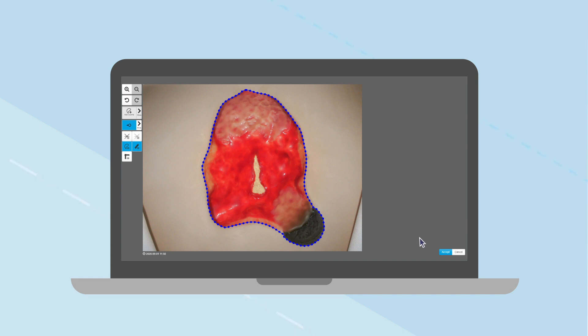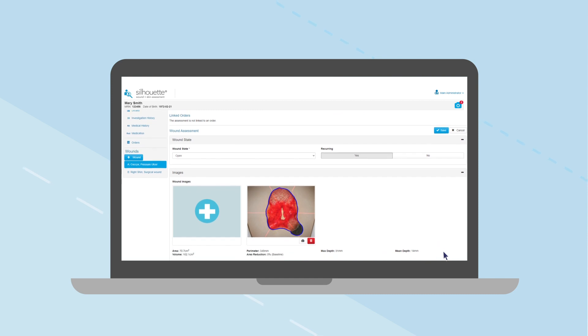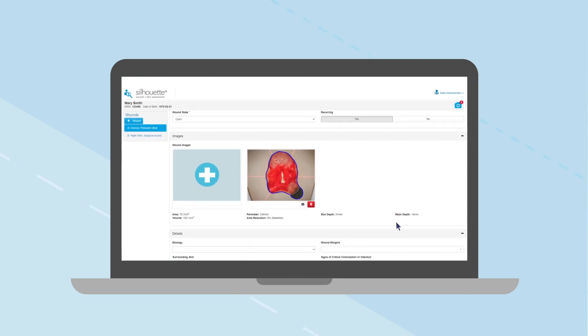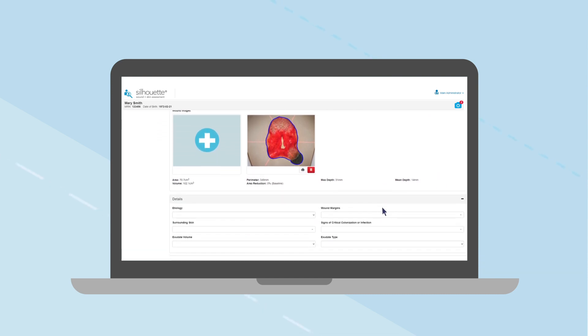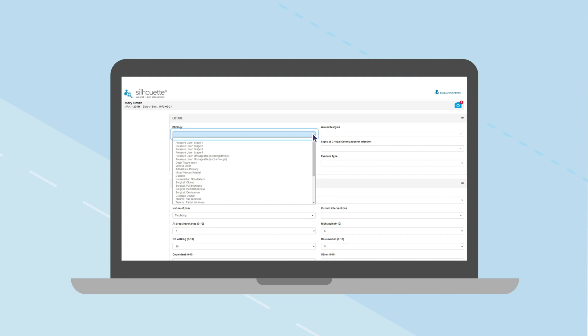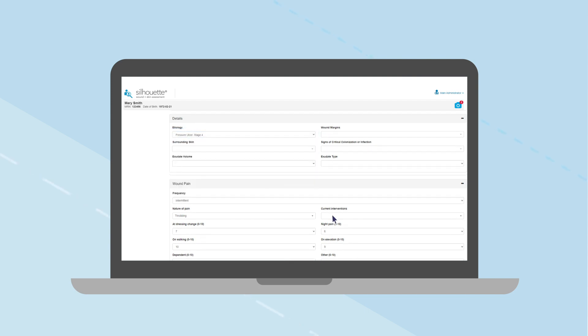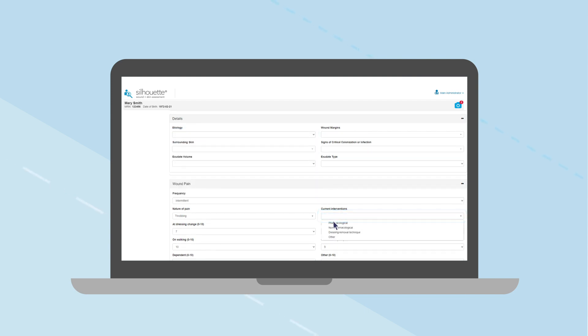Return to the wound assessment screen showing the image and measurements. Further assessment notes can be added at this point. These notes are configurable to meet your needs.